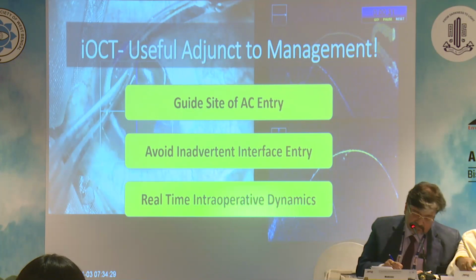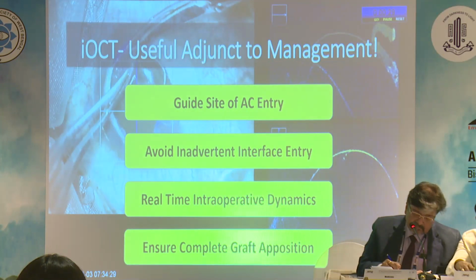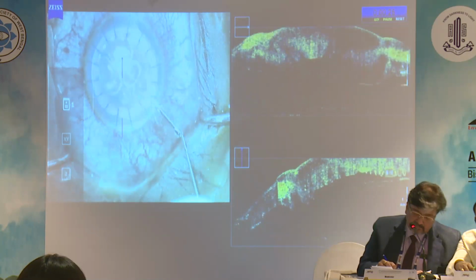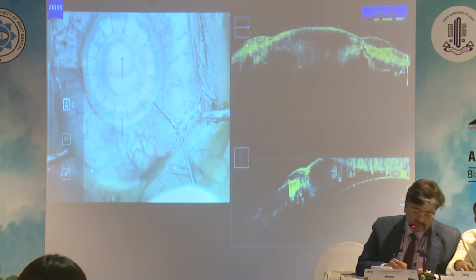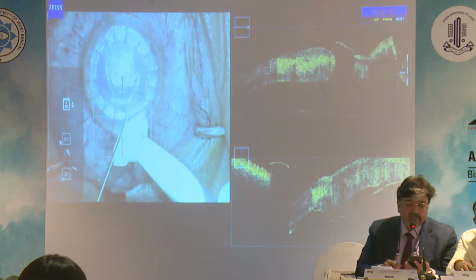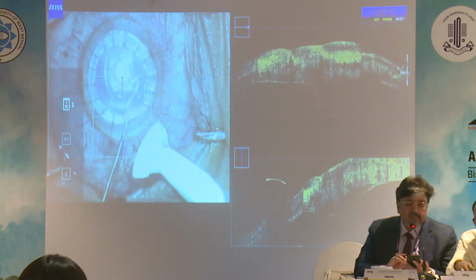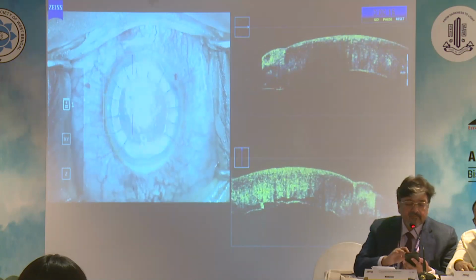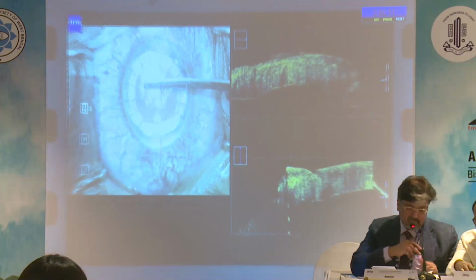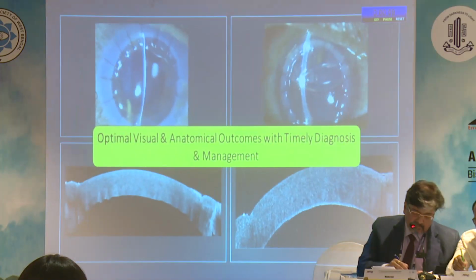Intraoperative OCT is a useful adjunct in management as it helps guide the site of entry into AC, helps avoid inadvertent interface entry, helps observe real-time dynamics during surgical maneuvers, and ensure complete graft apposition at the end of surgery. Optimal visual and anatomical outcomes may be achieved with timely diagnosis and management.